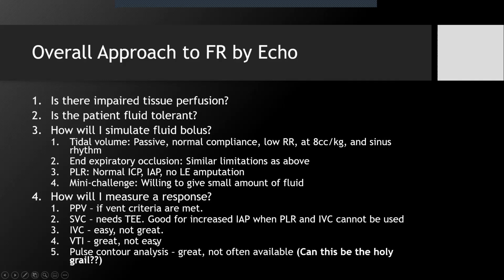You can use VTI, but it's great and not easy. Pulse contour analysis, really great, not often available, and maybe it will be the holy grail.